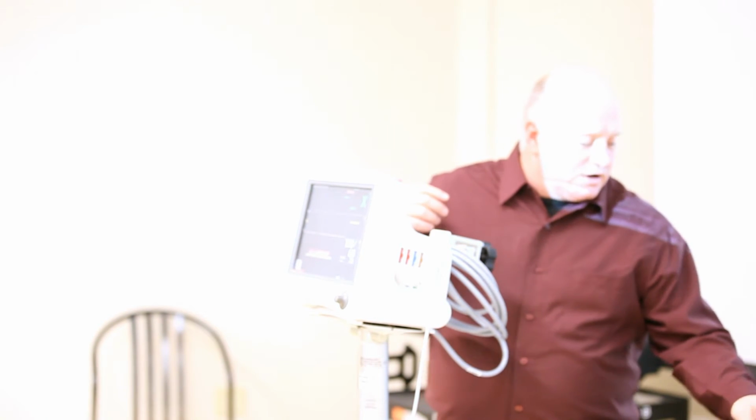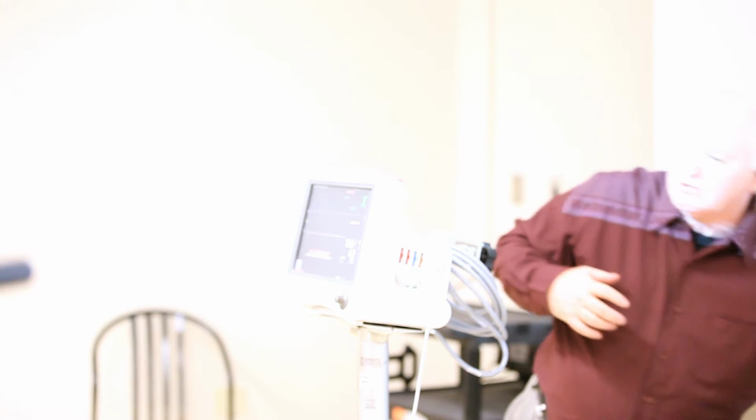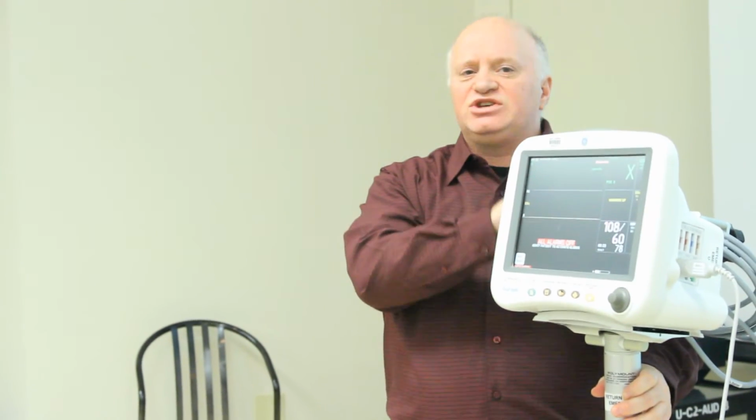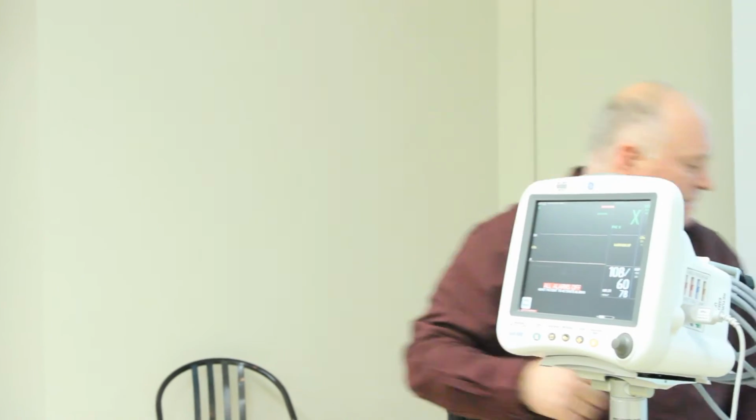We really have a couple of units. We have both side stream and mainstream in this organization. The portable units that we have at UH and in the resus rooms at Vic, I believe, are the mainstream model. Really, we can only do those with intubated patients. If I have my preference for the UH setting, in the resus room or in conscious sedation, I would go with side stream models, I think, all the time. Rationale: we can use it for non-intubated patients. So it's just far more versatile, and it's less technically problematic.